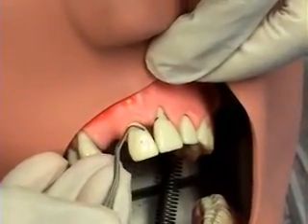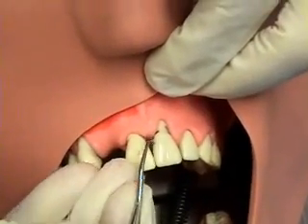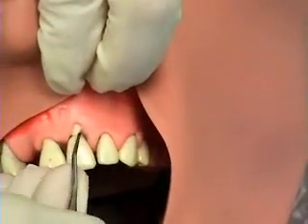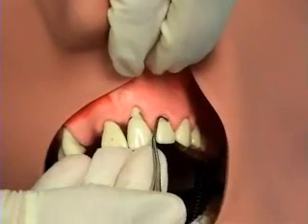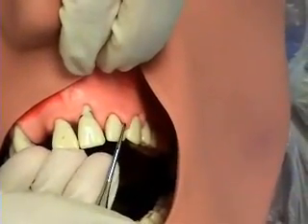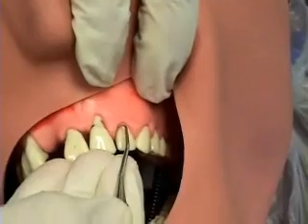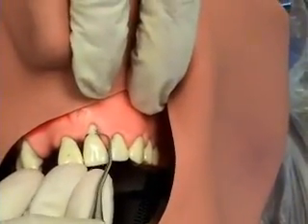Lateral pressure is dictated by the amount of calculus present. In proper adaptation for calculus removal, you have a face-to-tooth angle of approximately 70 degrees. Because the Gracey curettes are area-specific curettes, the clinician will need to use both mirror-image working ends to complete all surfaces. The clinician has flipped the instrument to the opposite working end — we clearly do not see the face of the instrument, and we see parallelism of the lower shank, along with adaptation of the toe one-third and that rocking rolling arm motion.